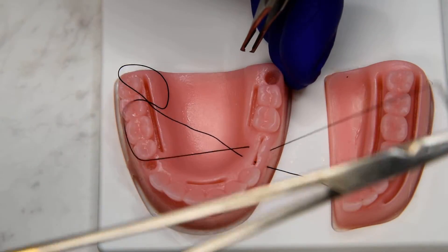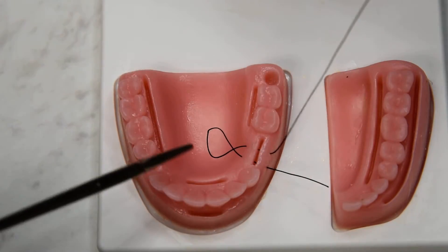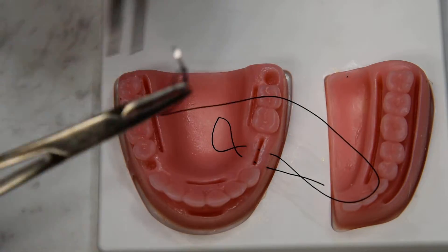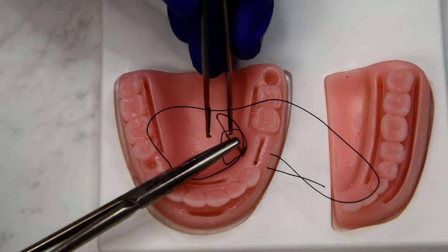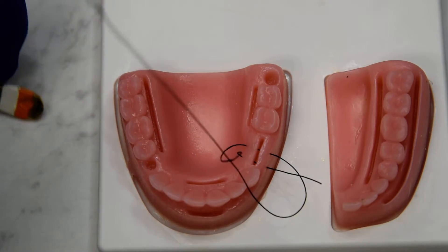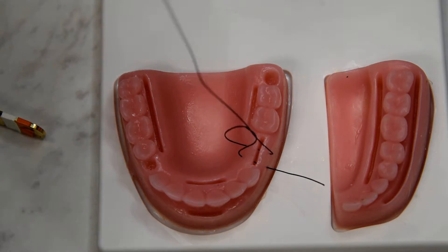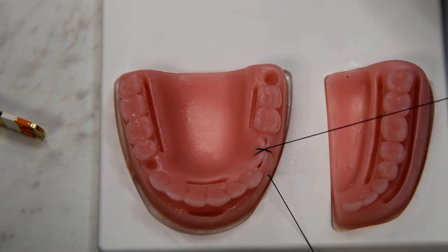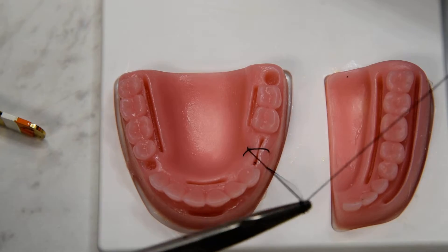The difference in this variation is that we leave a loop on the lingual — you can twist it or not — and before we tie, we're going to pass our needle through the loop. As we tighten, we'll see a bit of a crisscross as well as our mattress.